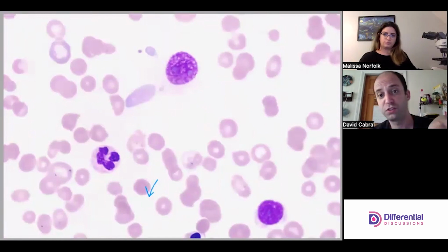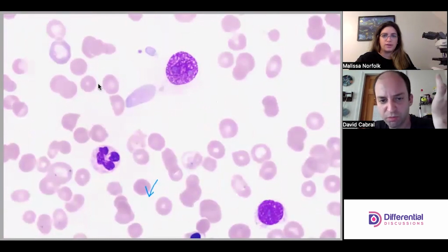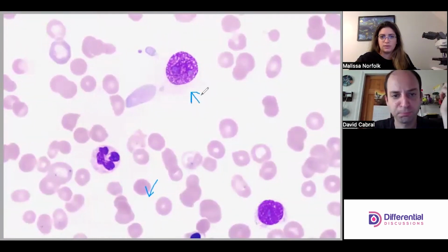And so we have two. Is there cytoplasm on that one? It looks like in the bottom right there is. It looks like we got two frags. Yeah, two frags. This one, and that one.